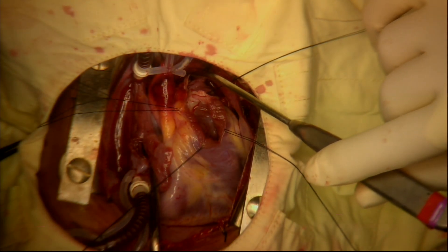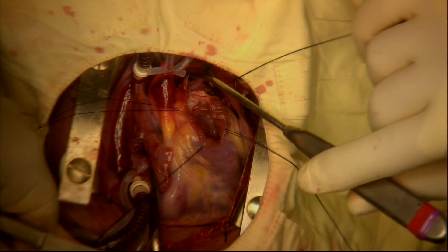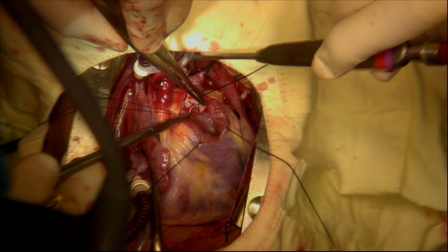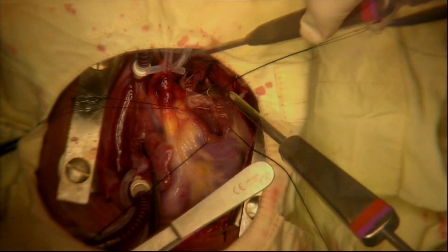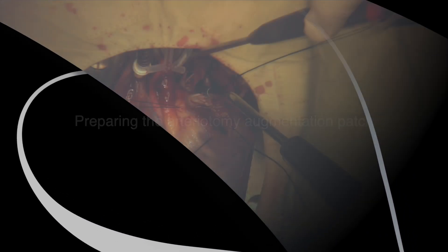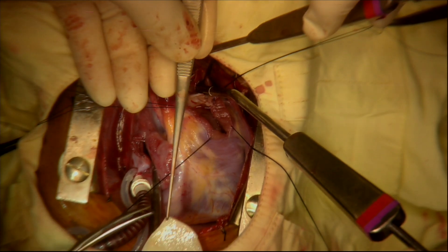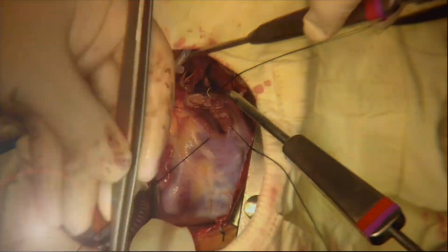The top corner of the pulmonary artery is extended in the direction of the left pulmonary artery. The leaflets of the pulmonic valve are tacked back with sutures and a patch of bovine pericardium is prepared to be sewn in place. The patch is trimmed to the correct size and one of the ends is tailored to fit into the corner of the left pulmonary arteriotomy.